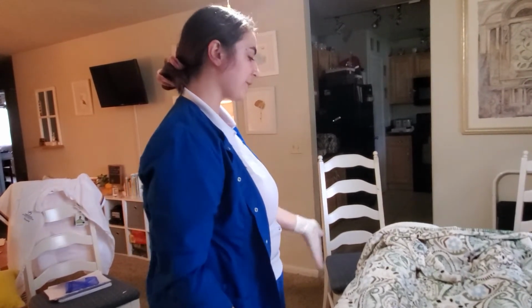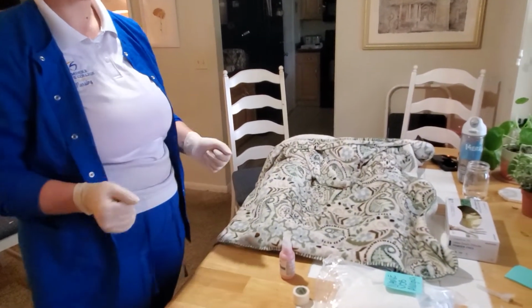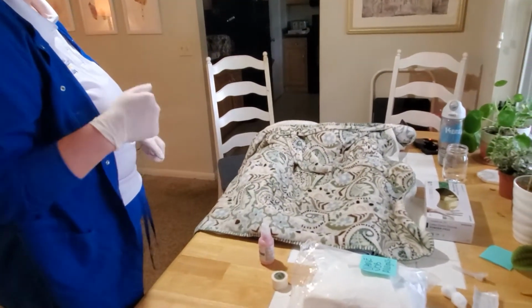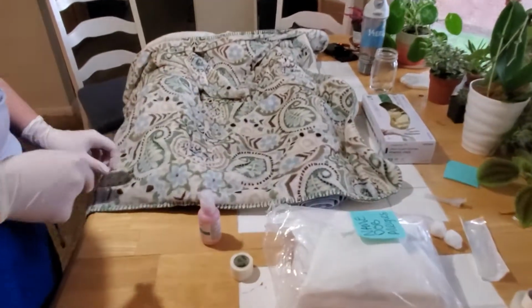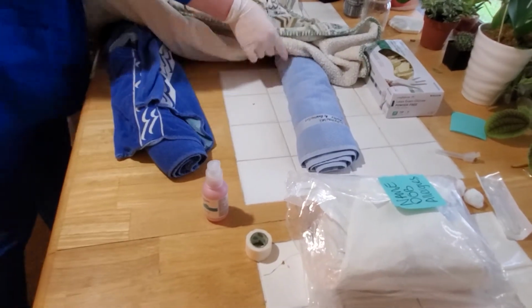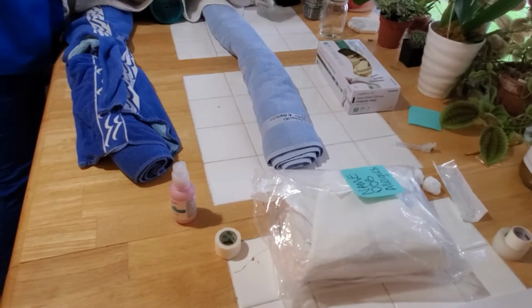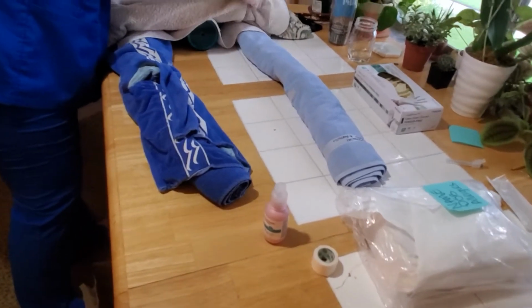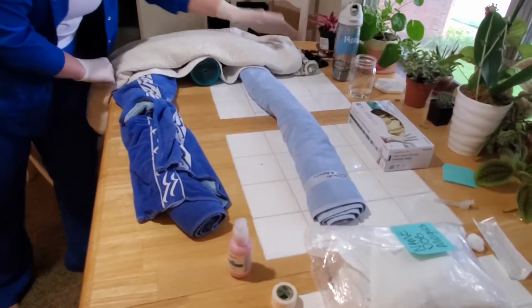So I'm going to begin by raising the bed to a comfortable position for me so I don't break my back. And I'm going to now lift this blanket, Anna, just so that I can access the urethral opening. But I'm going to leave it on the top for you so you don't get cold. So, just like so. All right.